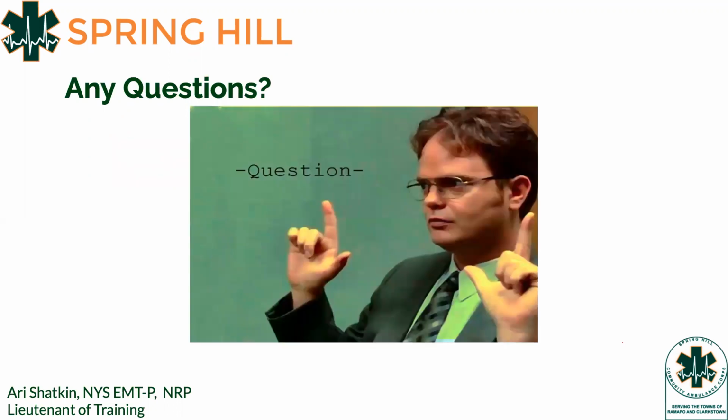All right, any questions? No, I actually have one question. If we apply it as BLS, does ALS have to come along or no? It's a BLS skill. If you do apply it, they are in respiratory distress or failure, they should be coming. Right. Although some Rockland paramedics won't. But I would QA the chart and I'd flag it for that, yes. Any other questions?